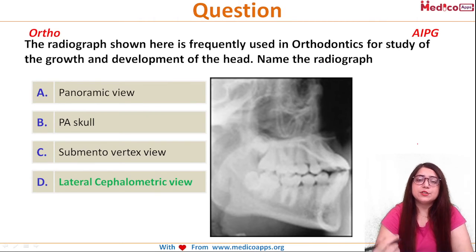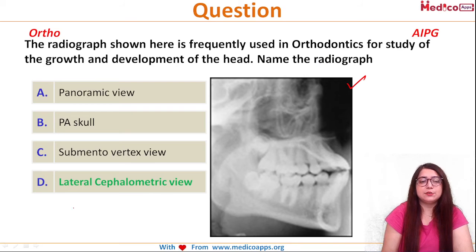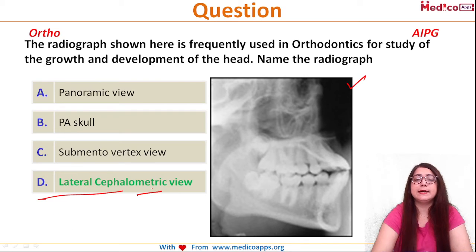Now coming back to the question, this image is of a lateral ceph. So this is the correct answer.